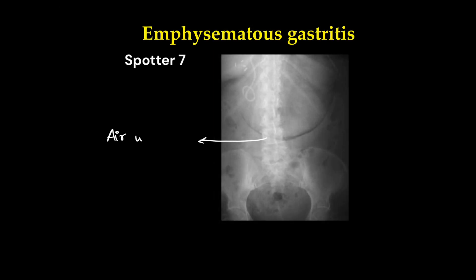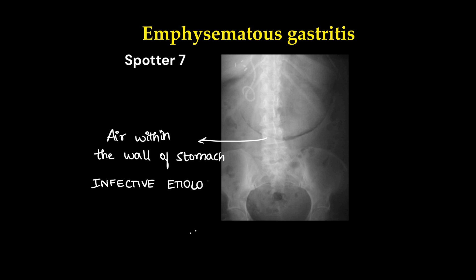This was emphysematous gastritis. Here we can see air foci within the wall of the stomach, in the shape of the greater curvature of the stomach. This happens because of infection by anaerobic microbes.